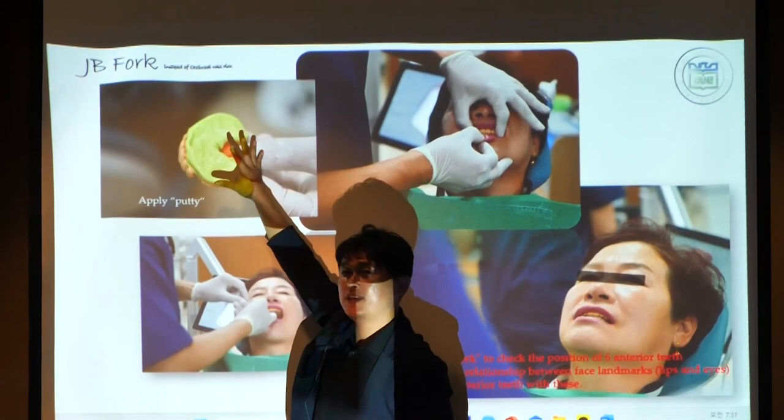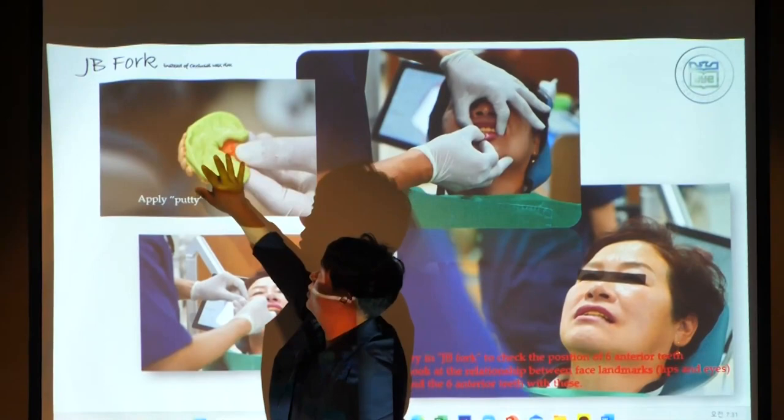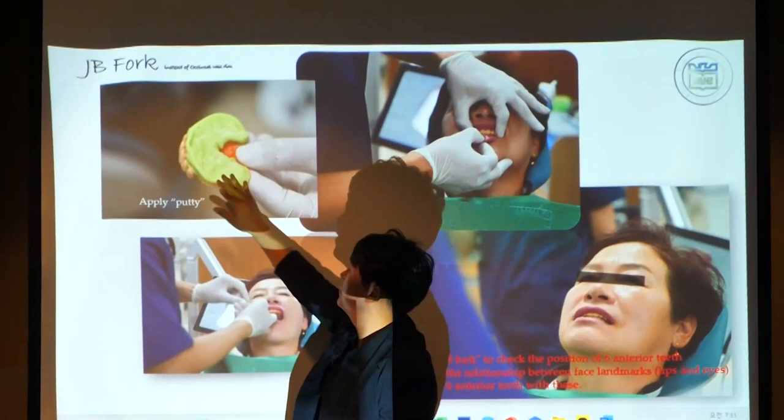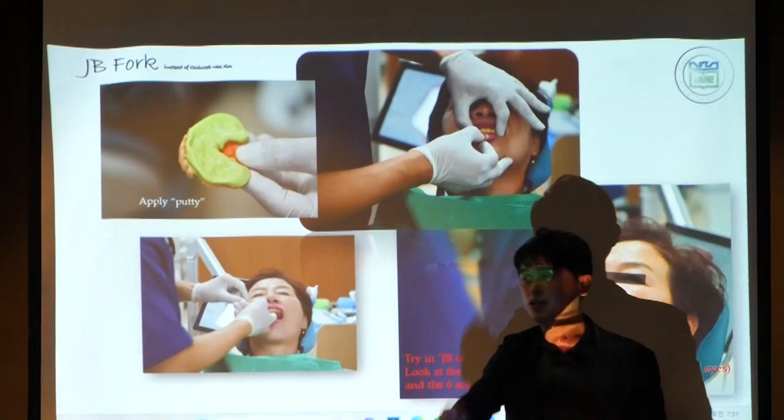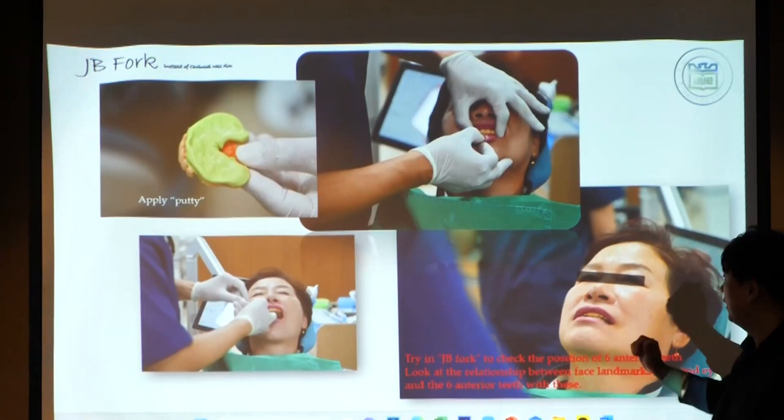You know, it's not an impression. It's like taking a bite. So you can apply this body in the anterior part or the alveolar ridge area. Understand? And then put it in the oral cavity, and at that time the patient is looking in the mirror together. And then I position the six teeth, and I put the upper plate in the oral cavity, and I discuss the position with the patient.